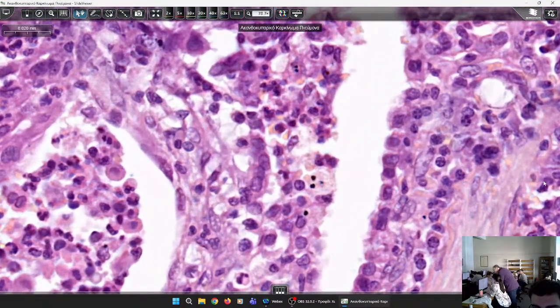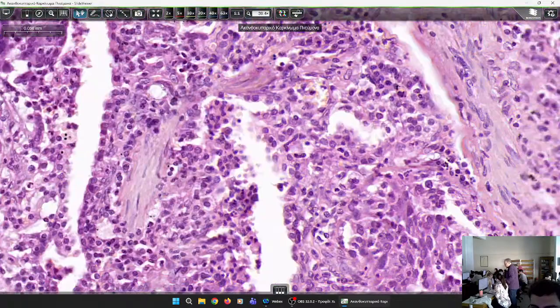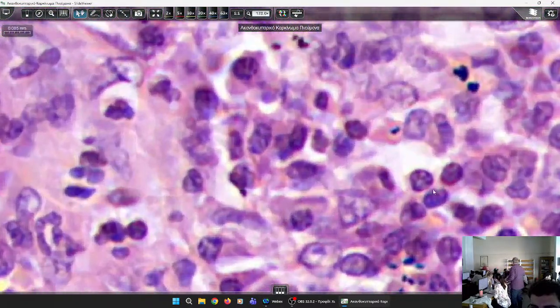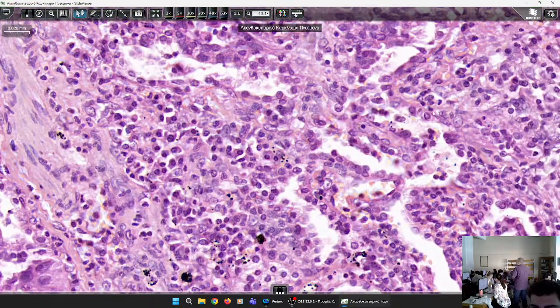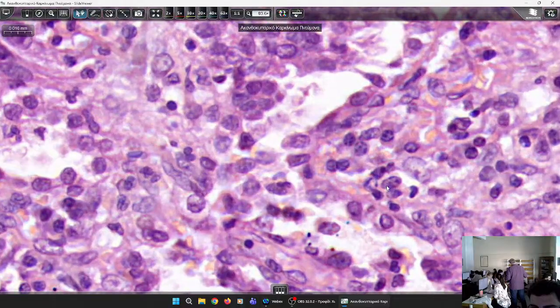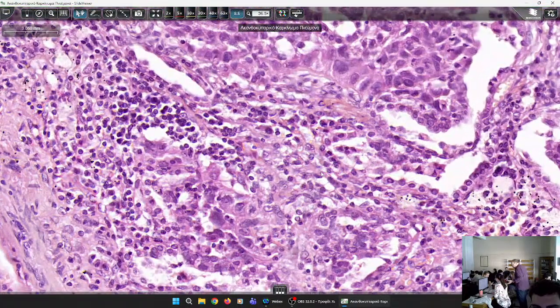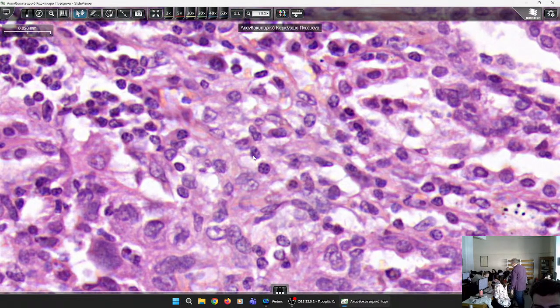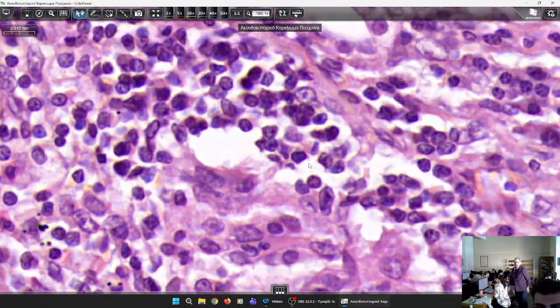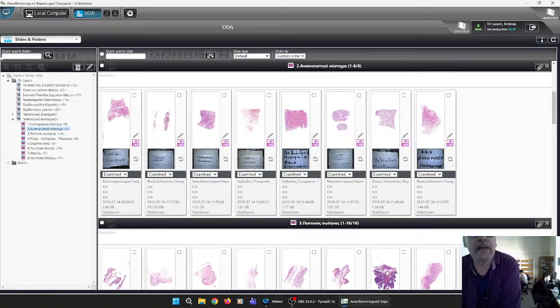You said it was high grade, and that's because it looks different from the normal. Yes, it's different from normal squamous epithelium, and the only evidence of some sort of keratinization was the sufficient amount of pink cytoplasm in some malignant cells. If you have experience in diagnosis, you'll think that it is a squamous cell carcinoma. But you have to prove it, confirm it by immunohistochemical positivity for P40. Okay? Now, let's study the other type, which is an adenocarcinoma.